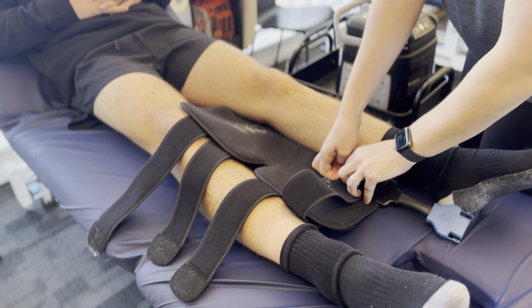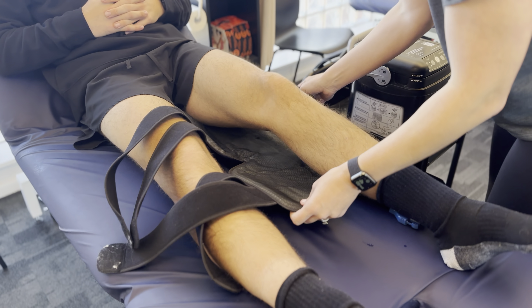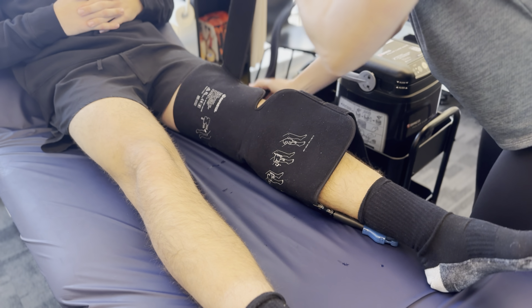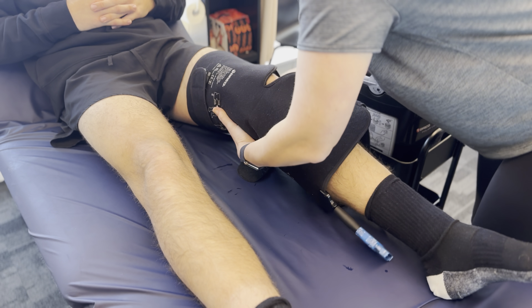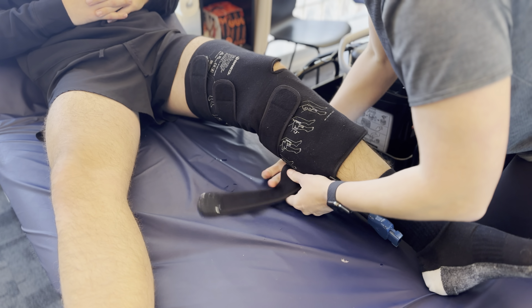The blue attachment will go on the bottom. Place this under the knee — where the slits are is around the knee joint. It doesn't matter if you're off a little bit; you want to turn it around to get the majority covered. It can be a little bit annoying when you're first putting on the Velcro, particularly if your knee is a little bit sore, so you might need the help of someone else to do it up for you.